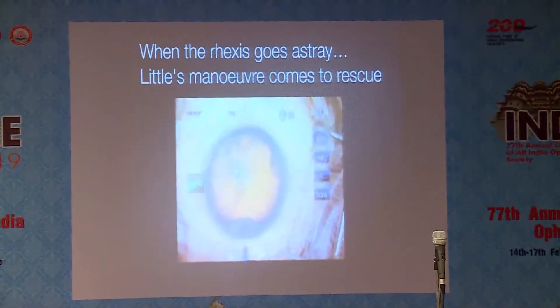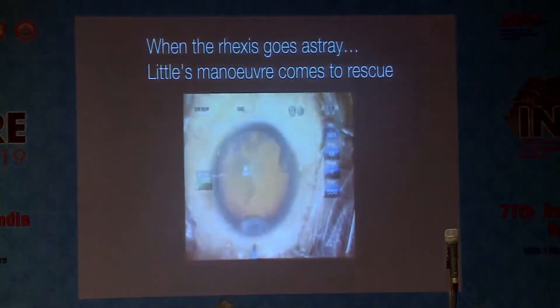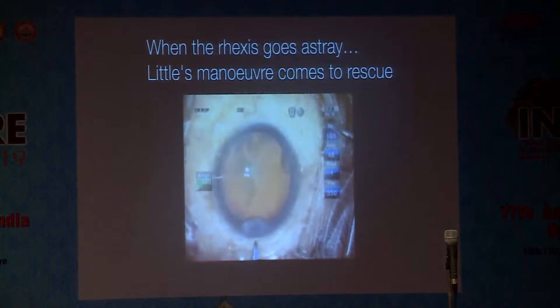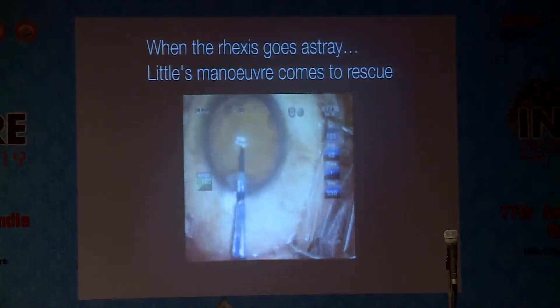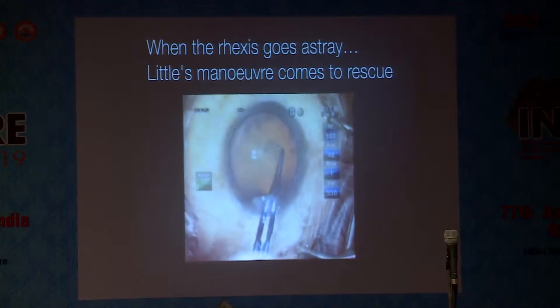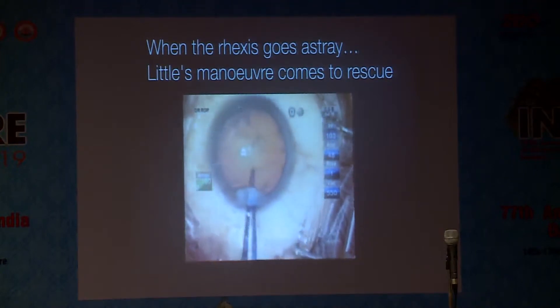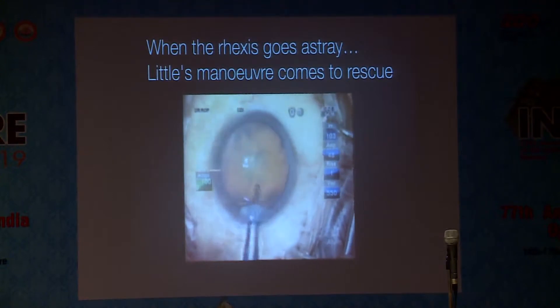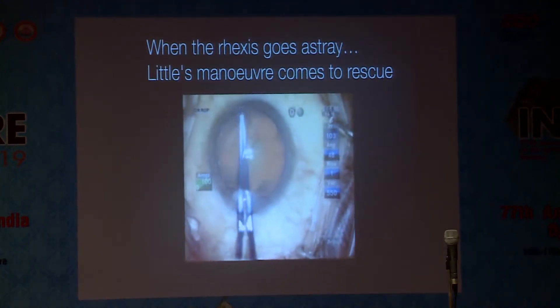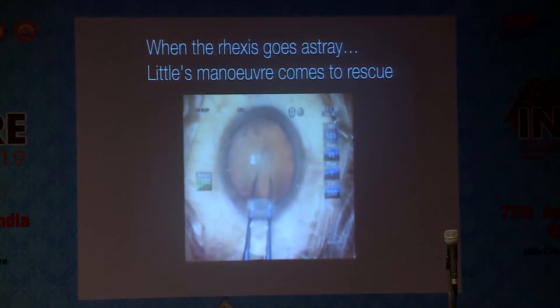How many of you are sure when the capsulorhexis runs away? When it runs away, the maneuver which is followed is basically shown in this video. The capsulorhexis is being done in the routine way. The capsulorhexis flap is being formed, and suddenly you realize that it has extended to the periphery. I cannot stop it because there are some issues. Now what do we do?